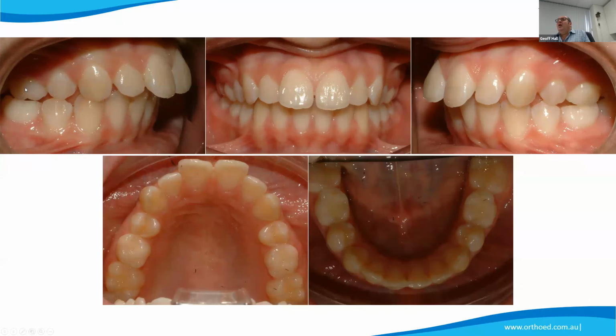And from the Ceph, we would say her upper incisors are a little bit proclined. Clinically, it doesn't look that bad, but they are definitely a bit proclined. We would agree. She doesn't really occlude terribly well at the moment either, and she appears from her tongue position to be using a tongue thrust to get a seal. This is what you might call an incomplete overbite, because she doesn't actually have contact of the anterior teeth. Most patients have to have a tongue thrust to form an intraoral seal.